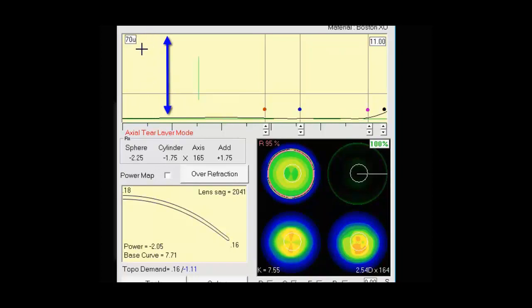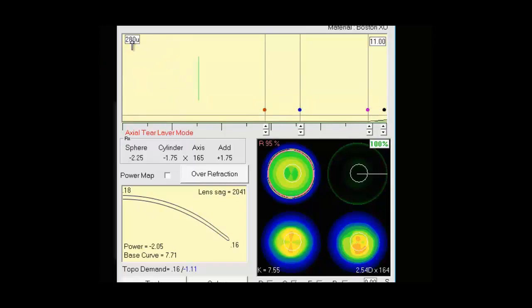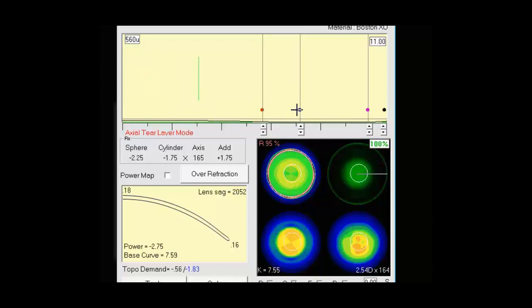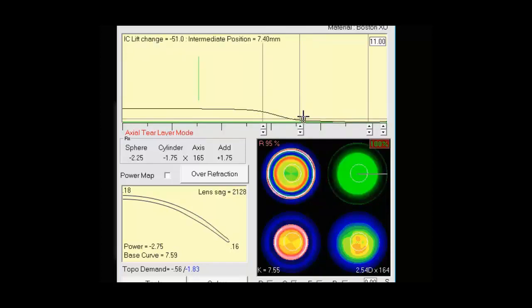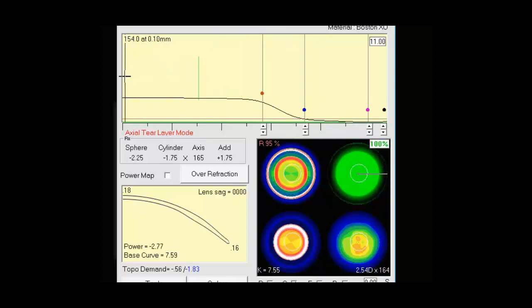If you're doing large diameter lenses and you're aiming to have more clearance, we can toggle this so we can make bigger changes and immediately have more clearance. So this is showing now 154 microns of central clearance. And as you see, if we switch back to a regular 70 micron view, everything would be off the screen.